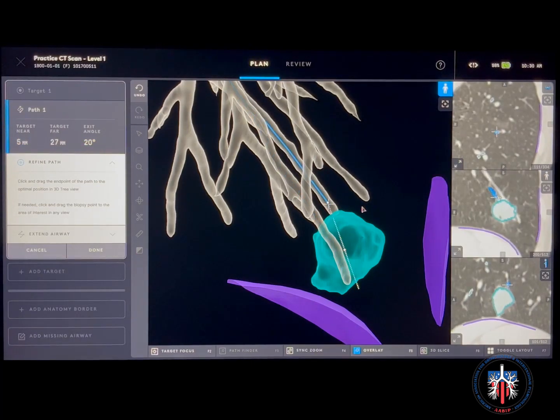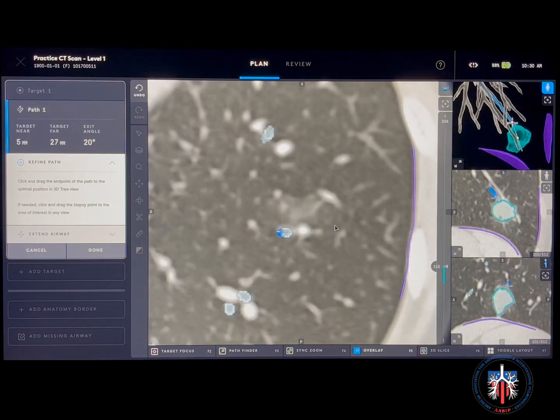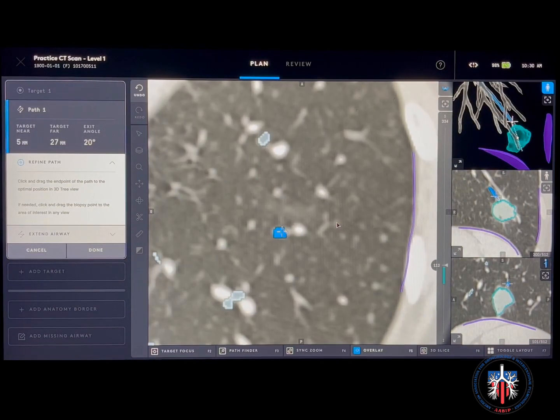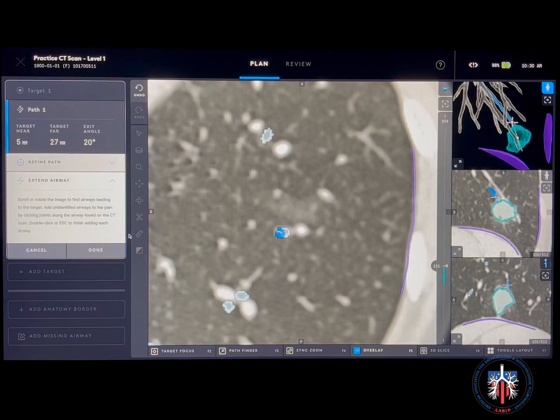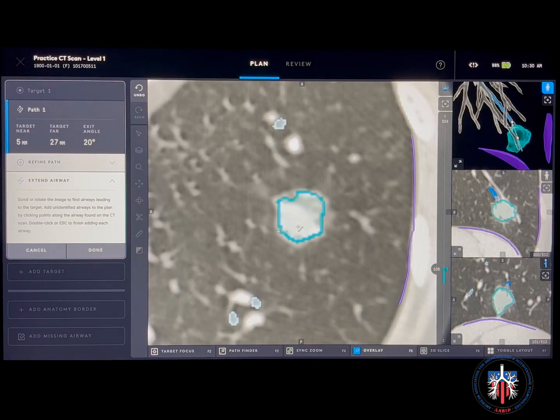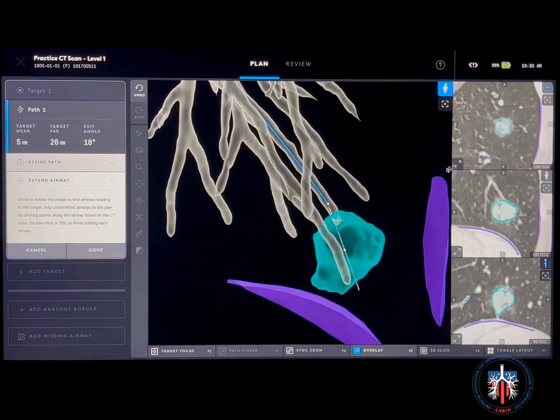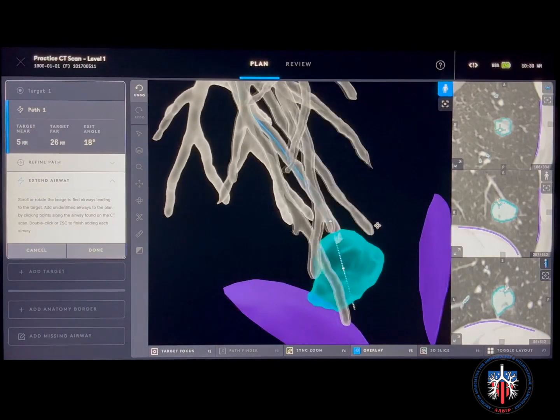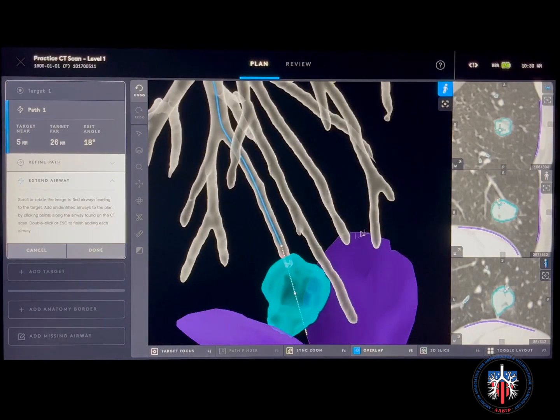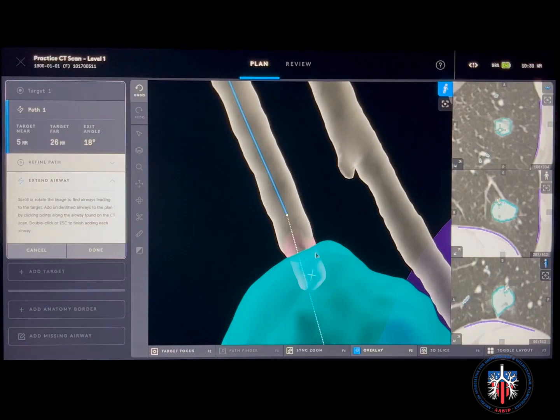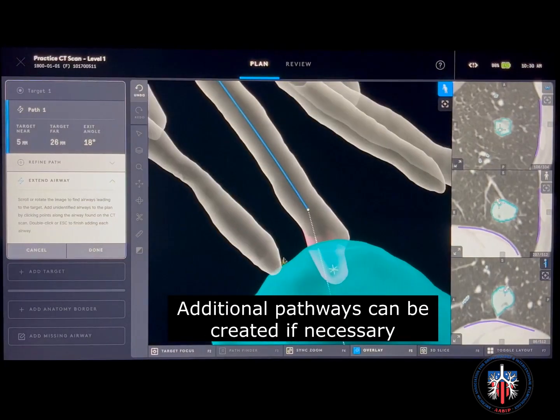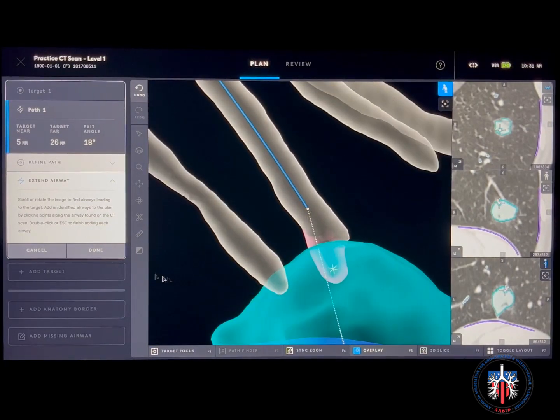You also have the option of extending the airway. To extend the airway, find the white end point and click extend airway. Click on the end point and drag the red line as many times as needed to reach the target nodule. The extended airway will show up in pink and is useful in providing guidance for the operator in case of missing airways. Click done.